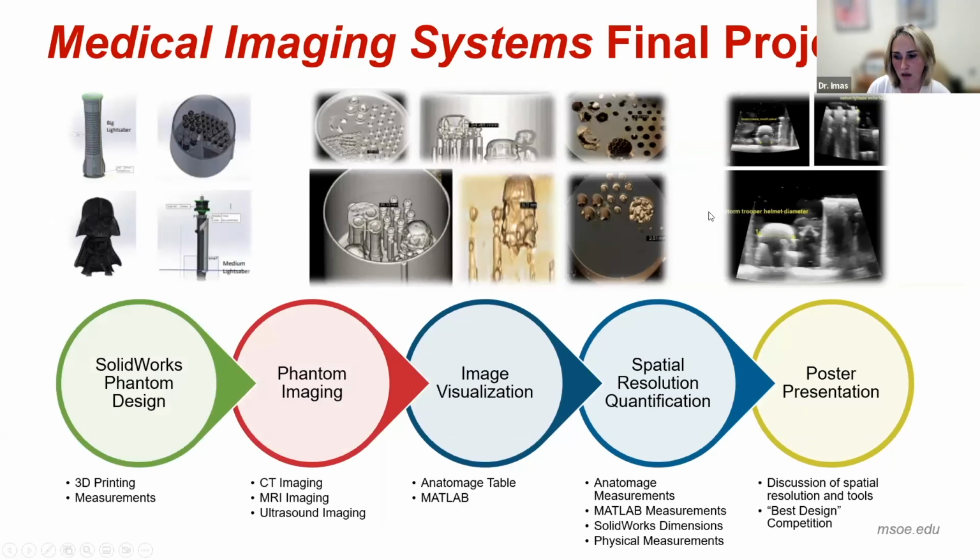Really briefly, this is probably the most out of the box use that we've had with the Anatomage table over the years. And it's a final project where my medical imaging students are asked to design an object that we normally use to test medical imaging systems, specifically for spatial resolution, or how small can we resolve a structure to be in the image.